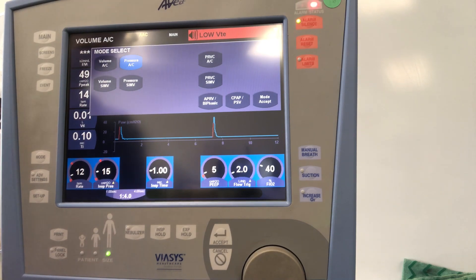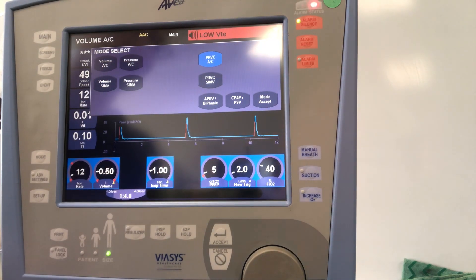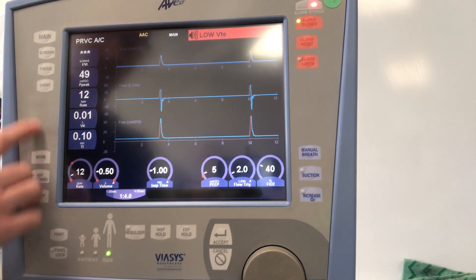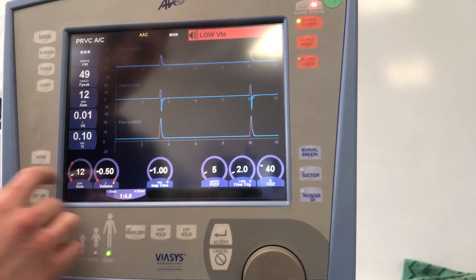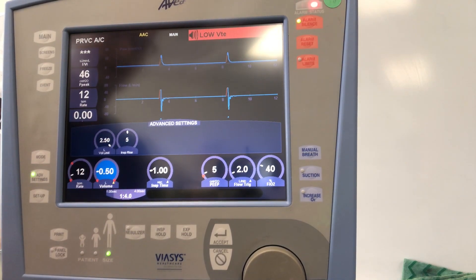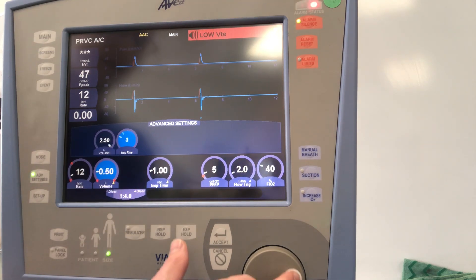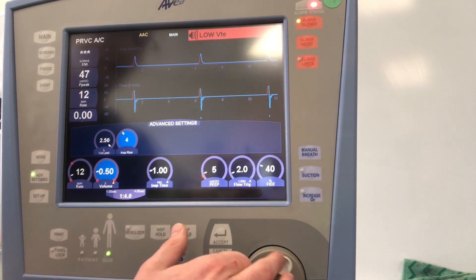We also have PRVC AC. If you want to use what you'd traditionally call auto flow, tap PRVC AC and hit mode accept — we are now in PRVC AC. Under advanced settings for PRVC AC, we have volume limit, which limits the volume the patient can take in during a breath. Inspiratory rise — we recommend keeping it around five, as it doesn't make a big difference to the slope of the breath.